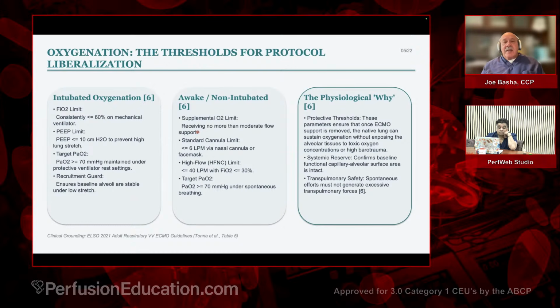And you want to make sure that you don't overtax the alveoli, trying to get more barotrauma or recruiting tissue that's just not ready to be recruited yet. So you want to keep your stretch to a minimum.